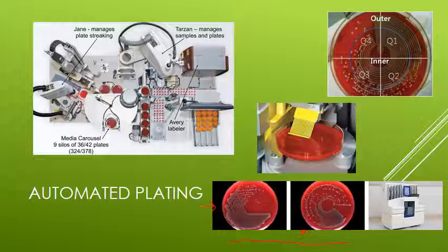Well, automated systems work very well for liquid specimens, not so much for swab. We haven't figured out how to do the swab one in an automated means right now, but it works very well for liquid specimens. And as you know, the number one specimen coming into most micro labs is, what is it? It's urine, okay, which is a liquid specimen. So that can easily be taken care of. If we don't have to plate any of our urines, we can let a machine do it, and we're assured that they're all plated exactly the same.